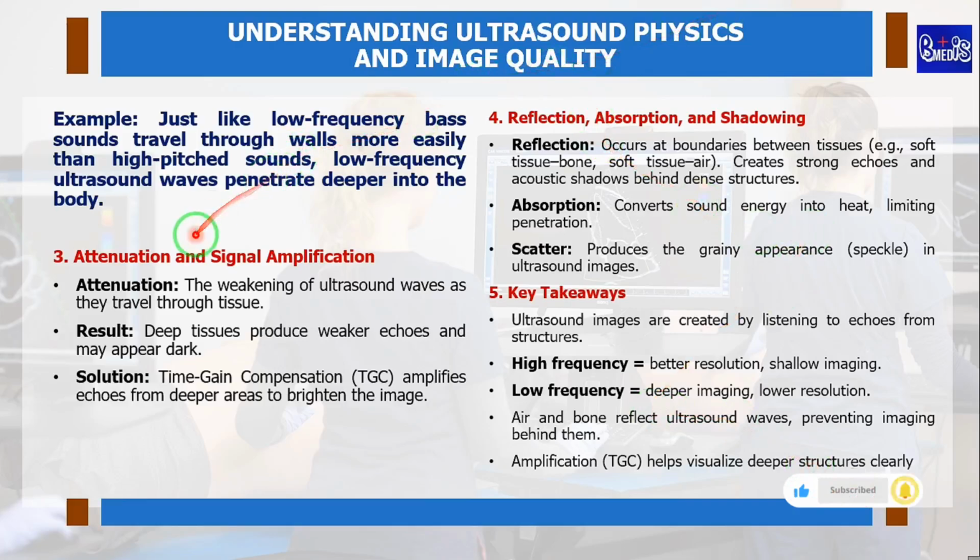the continuation of image quality. The third one is attenuation and signal amplification. Just to help you understand, low frequency bass sound travels through walls. If you are in a place where musicians are rehearsing, you will always notice that the bass sound gets to you easily, more compared to sounds with higher pitch.